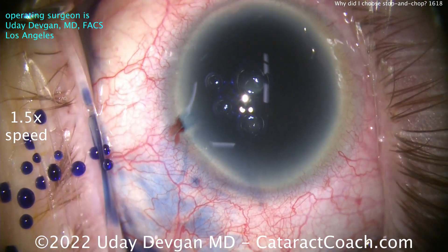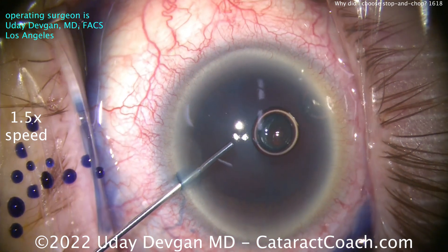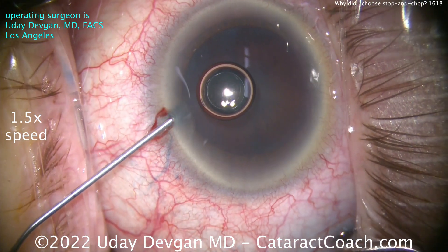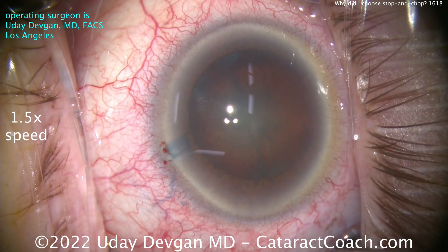The patient has basically one eye. The other eye had some bad angle closure glaucoma issues and is now no light perception, and we are operating on the remaining good eye. The patient has deferred and deferred cataract surgery because of fear. And so now it's not an easy case — it's a dense cataract, a small eye.